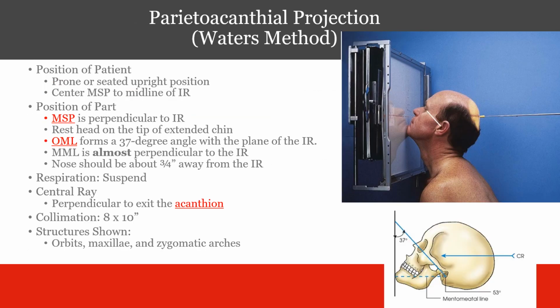The parietoacanthial projection, Waters method. Your patient can be prone or seated upright. They can center the mid-sagittal plane to the midline of the image receptor. The mid-sagittal plane should be perpendicular to the IR. We want to rest the head on the tip of the extended chin. The OML forms a 37-degree angle with the plane of the image receptor, and that means that the MML is almost perpendicular to the IR.